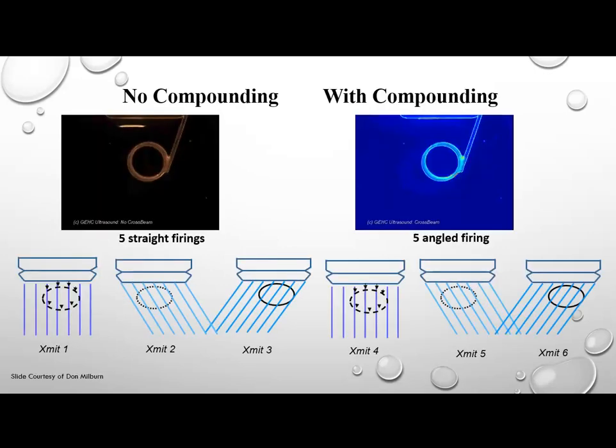Well, with spatial compounding, we see with no compounding, the echoes all go straight down from our transducer, and of course some of them come back to the transducer, some of them won't. With spatial compounding, what we're doing is we're sending our pulses straight down and also at angles, okay, and so we're effectively being able to strike specular reflectors at 90 degrees from multiple points.